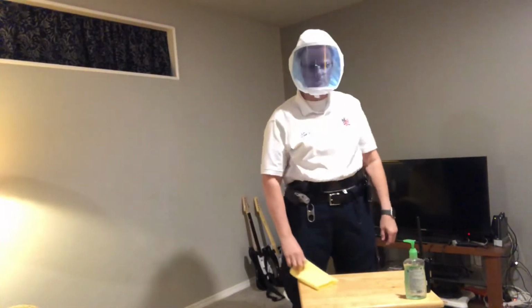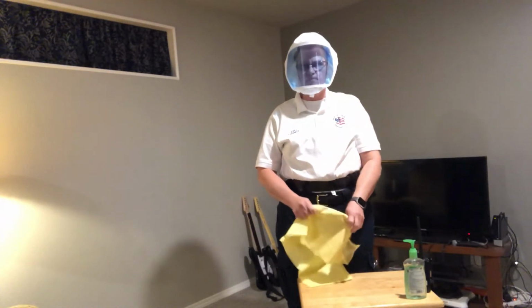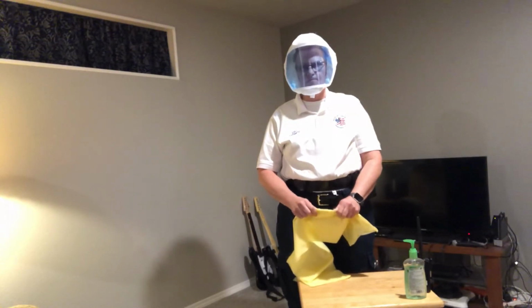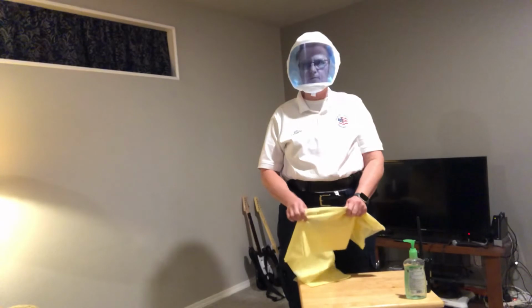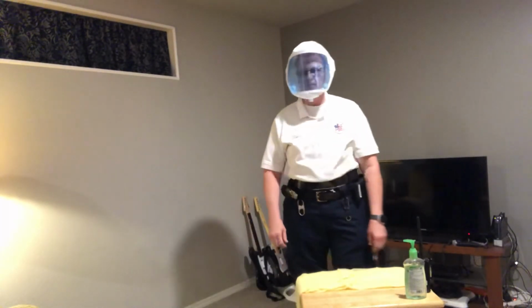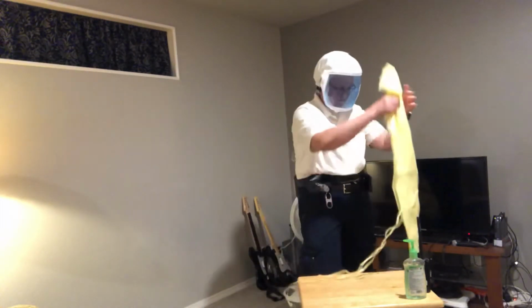Next, so now that she's got it on, it's fit properly. It's a good, tight, snug fit on her head, right? When she moves her head, it's not wiggling all around. It's not sliding all around, right? Even as she moves her head like that, it's staying in place. Now she's going to go ahead and put on her gown over top of the PAPR unit.